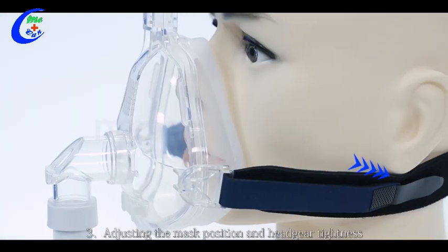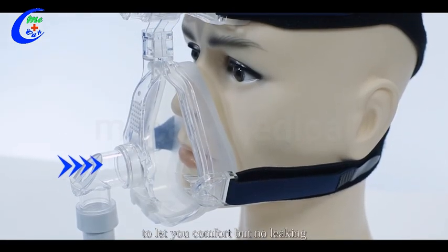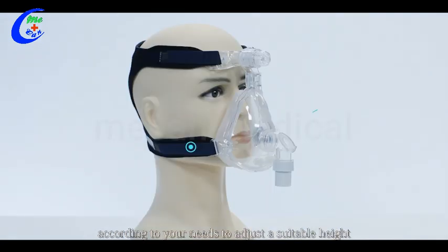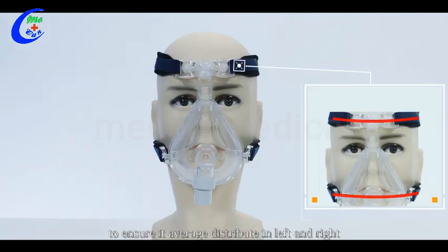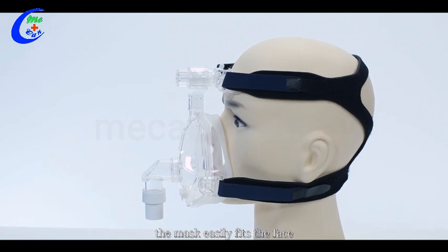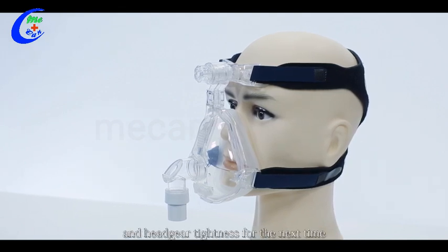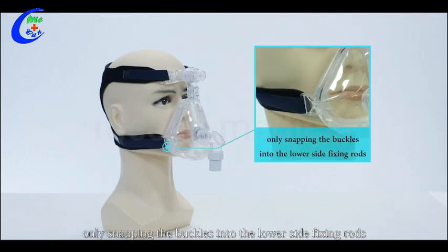Step three: adjust the mask position and headgear tightness to let you feel comfortable but with no leaking. Rotate the forehead fine tuner according to your needs to adjust a suitable height. Step four: adjust the headgear position to ensure it is evenly distributed on left and right. The upper and lower headgear are parallel and the mask faces evenly. Step five: once the mask has been worn, you don't need to repeatedly adjust the mask length and headgear tightness next time — only snap the buckles into the lower side fixing rods.